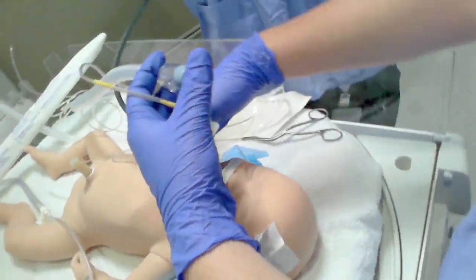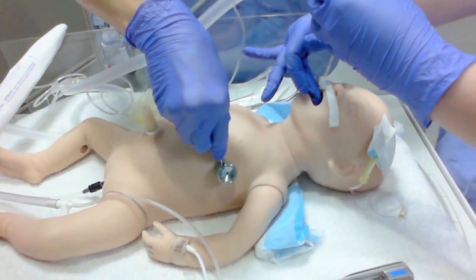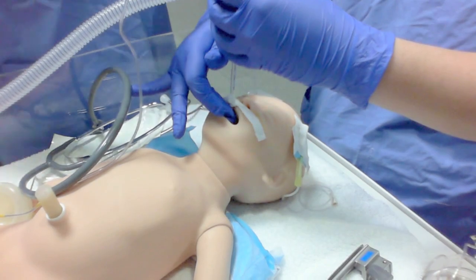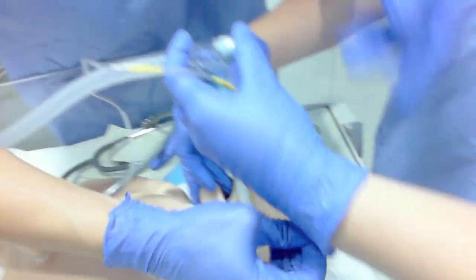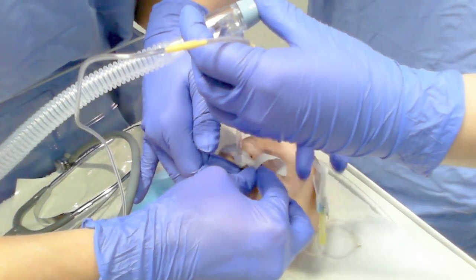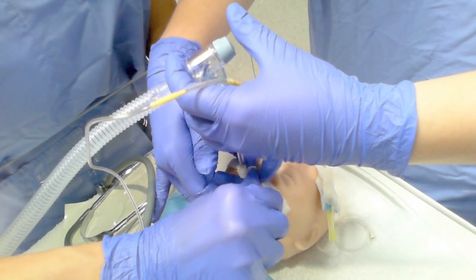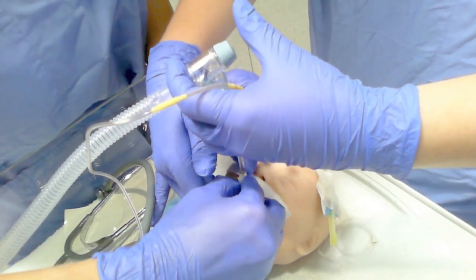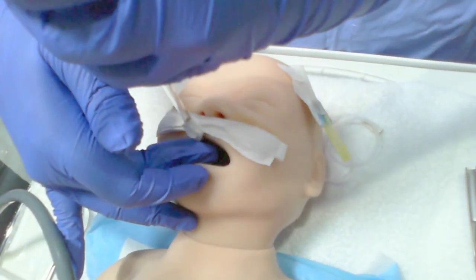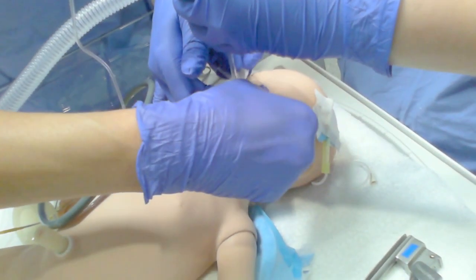At some sites, you will see them apply a mustache after the tube has been secured. Once again, confirmation of bilateral air entry.